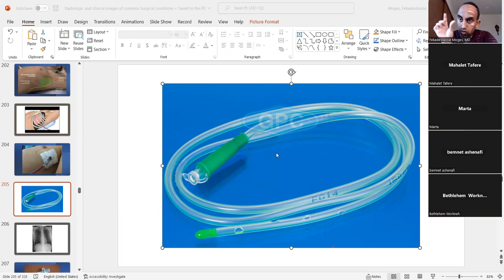I'm going to introduce this tube. It's going to be unpleasant, but it is going to save your life. I have to do it, it's a must. I'll be gentle. I will tell you to swallow when it reaches your throat. When I tell you, don't fight it, try to swallow it, or at least try to swallow your saliva. That facilitates the passage of the NG tube.